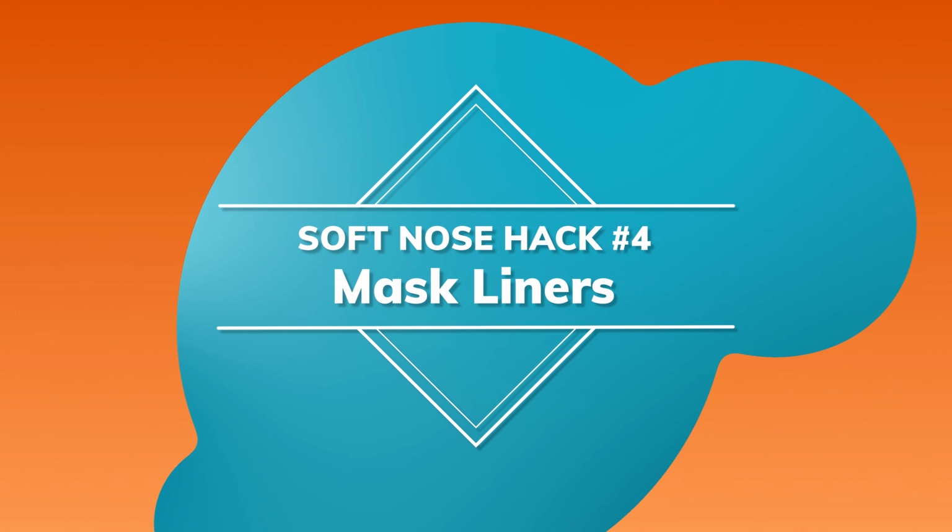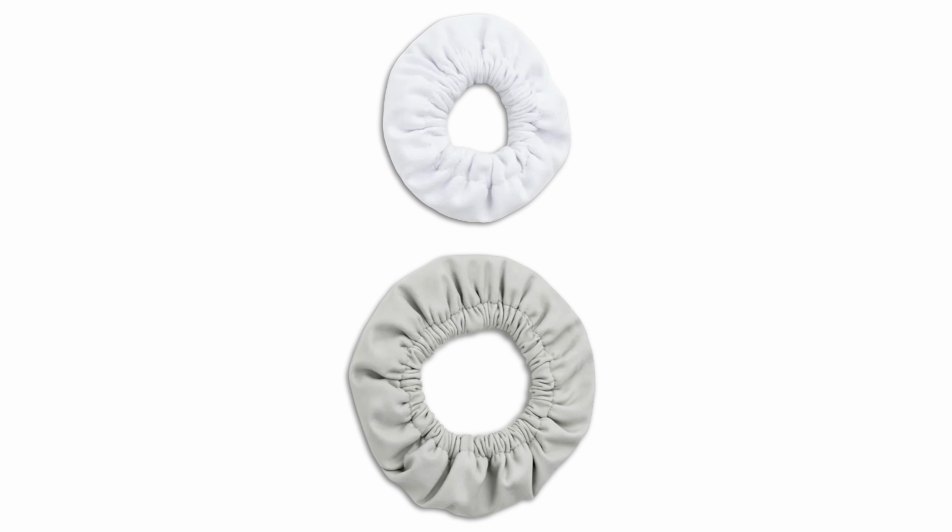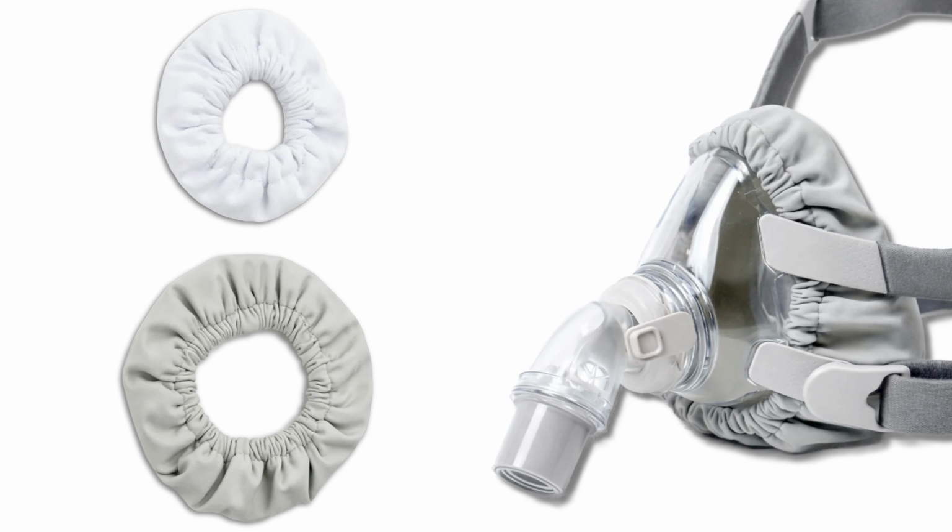Hack 4. As with other cases, mask liners can help with these noses sometimes, as they provide more structure to the cushion, which can help stabilize your nose while plugging small gaps that would otherwise have become leaks.